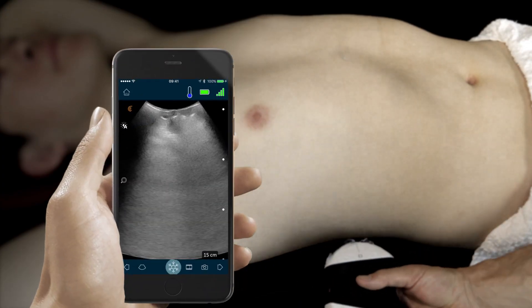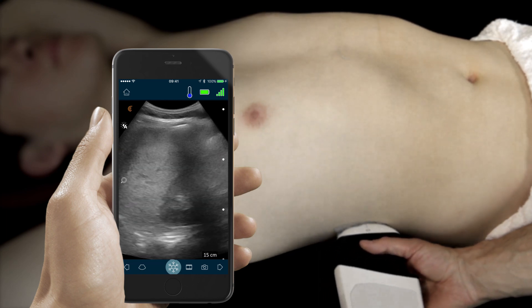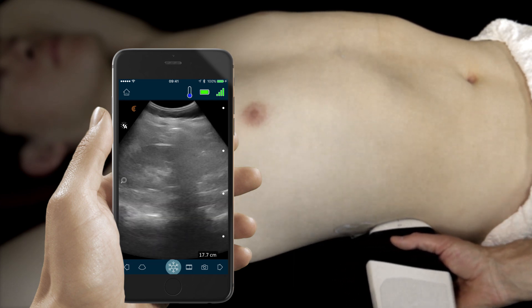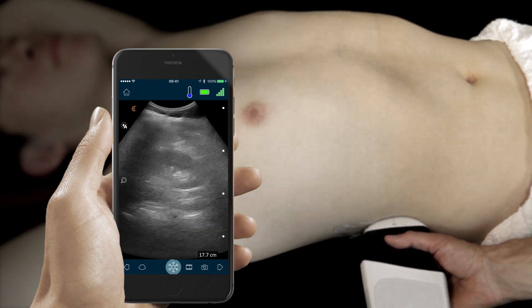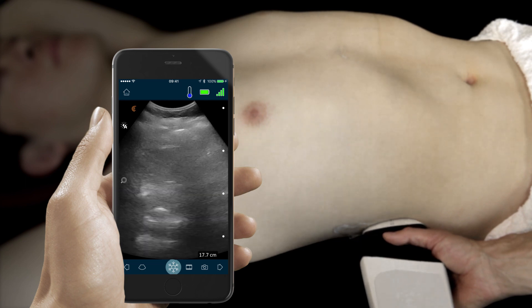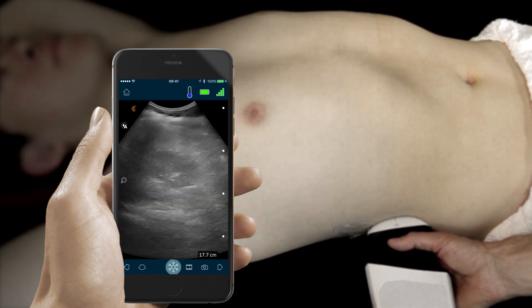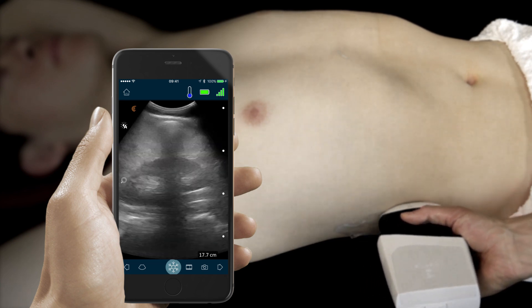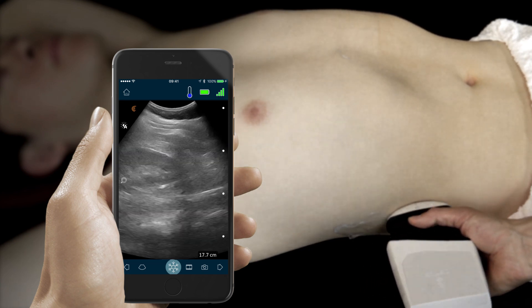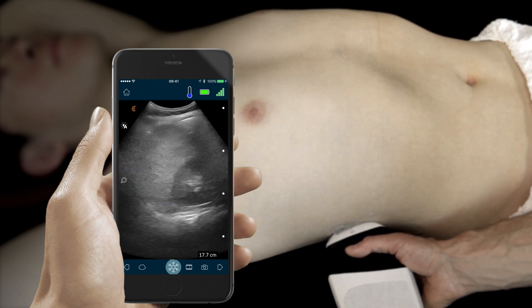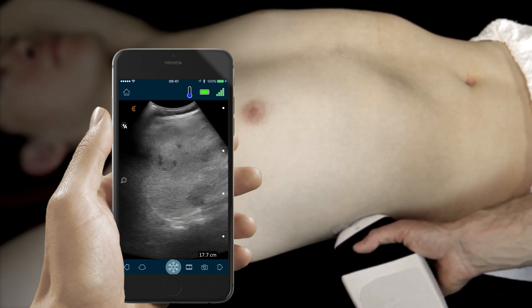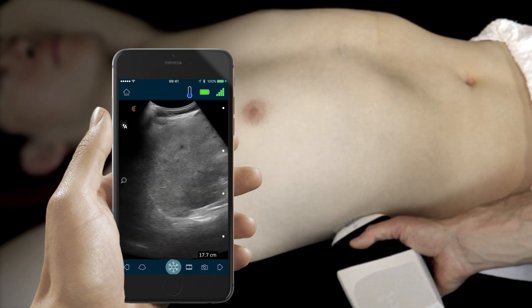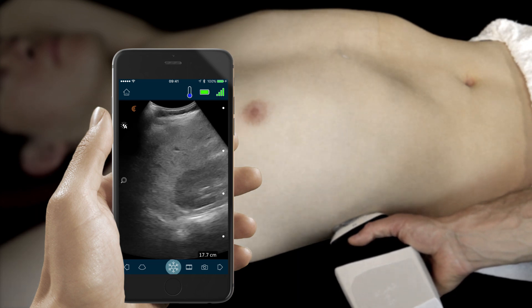Next, we'll examine the peritoneal space for any signs of free fluid. We're going to start by scanning the right upper quadrant, examining Morrison's pouch between the liver and the right kidney, fanning through to ensure that we find any small collections of fluid. We also want to ensure that we're seeing the inferior tip of the liver. Finally, we will turn our attention to the diaphragm, looking at the liver-diaphragm interface and looking for any sign of fluid on the opposite side of the diaphragm.